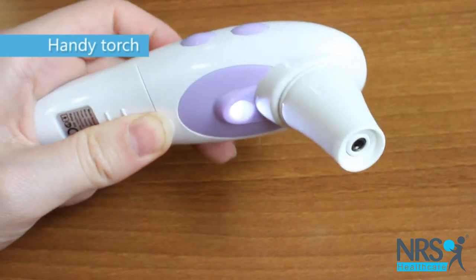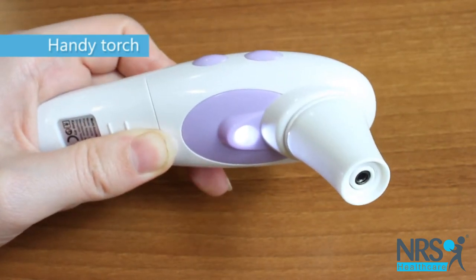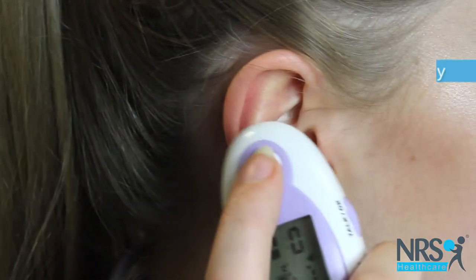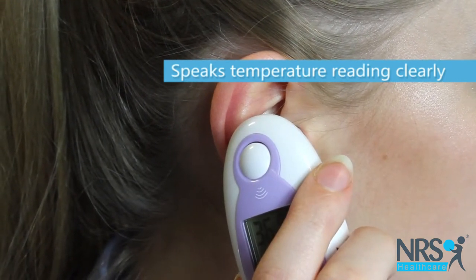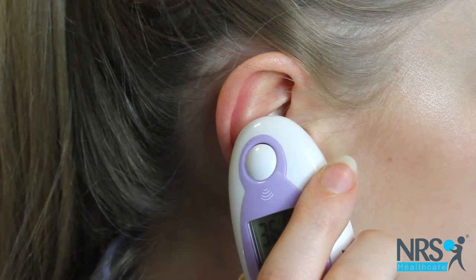as well as a handy torch for taking readings at night time. Simply insert into the ear and the reading is taken within 2 seconds. Your body temperature is 36.8 degrees Celsius.